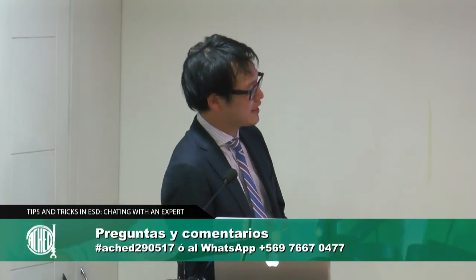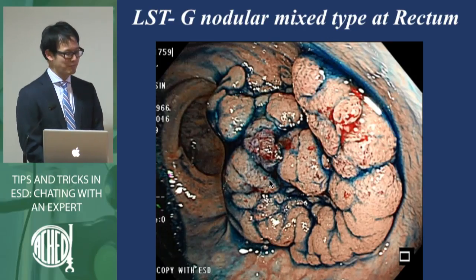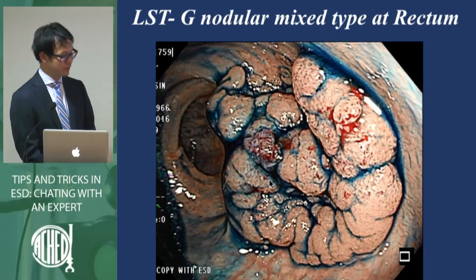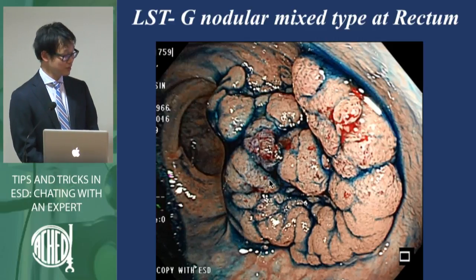Yeah, this case we checked by magnification endoscopy also before the resection. So this pit pattern is almost type 4, so maybe it predicts mucosal lesions. I agree to the piecemeal resection, but piecemeal resection has a much higher local recurrence. So if local recurrence occurs, the ESD procedure is also difficult.